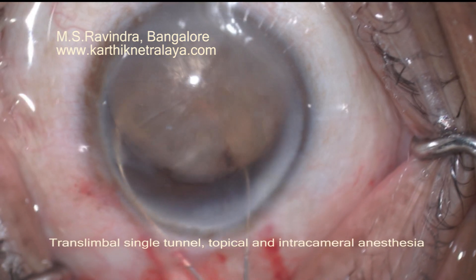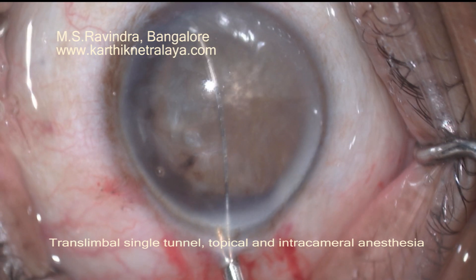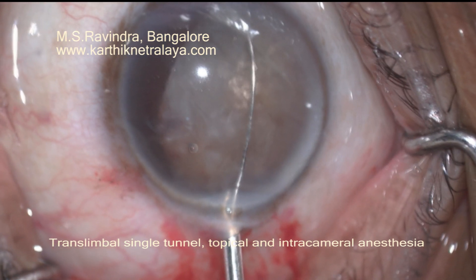Following a translimbal tunnel creation, trypan blue staining, and a good large CCC, this large nucleus has been prolapsed into the anterior chamber. It appears to be quite hard.